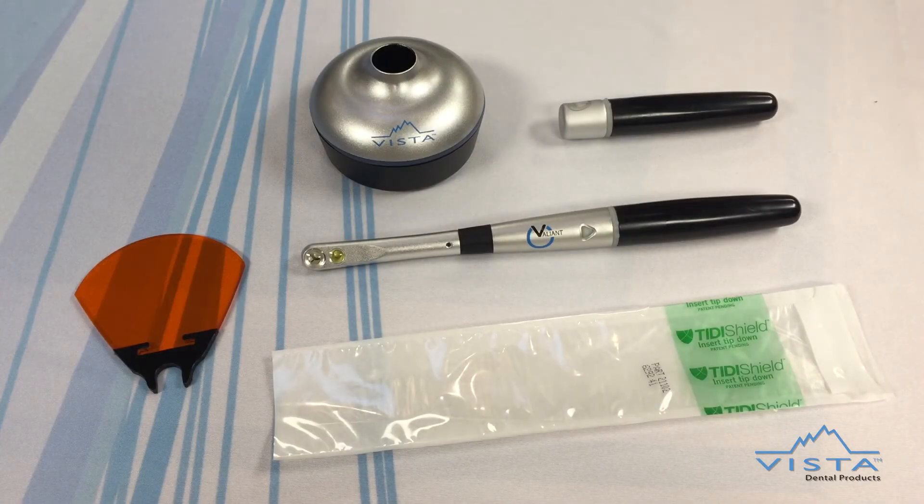The Valiant is ergonomic in style and lightweight, weighing just 72 grams or 2.5 ounces. The Valiant curing light is cordless and features a quick-change battery pack that is easily detached and reattached.